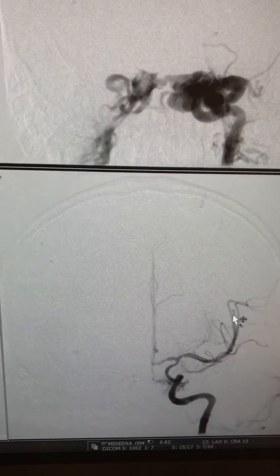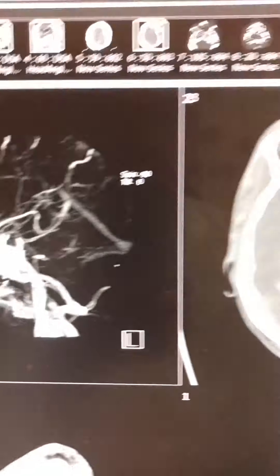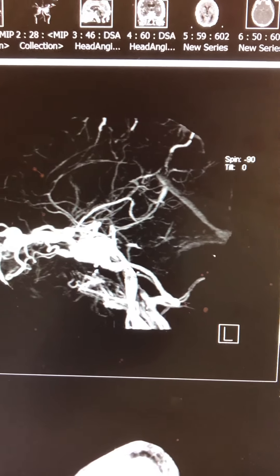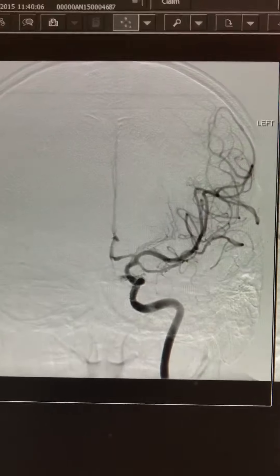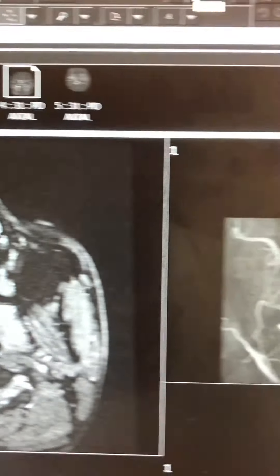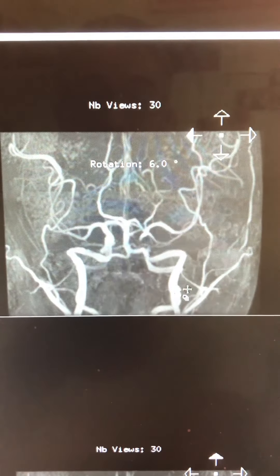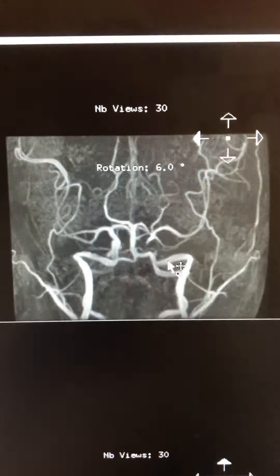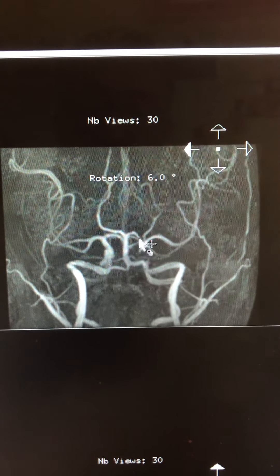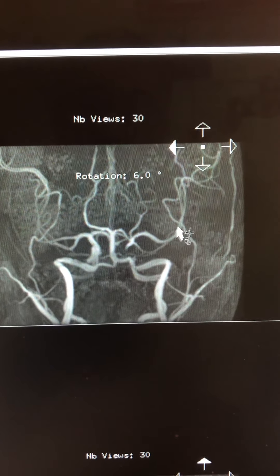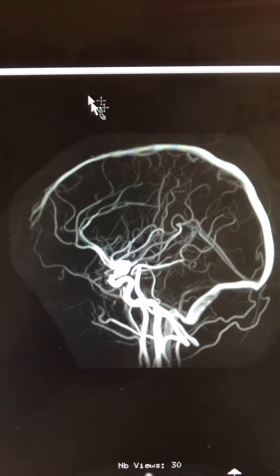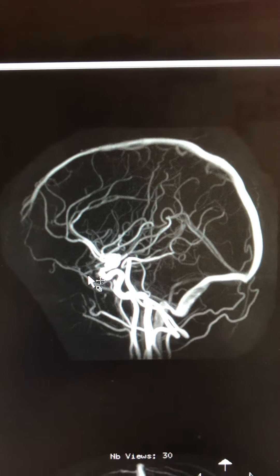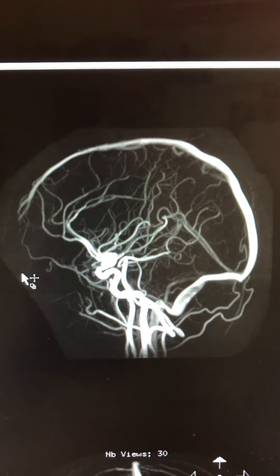When the patient came back for follow-up — more than two years later — this was the angiogram. There is very good flow still through the parent artery, no occlusion, and good flow to the left hemisphere. On the venous phase, you see no more communication between the artery and the vein.